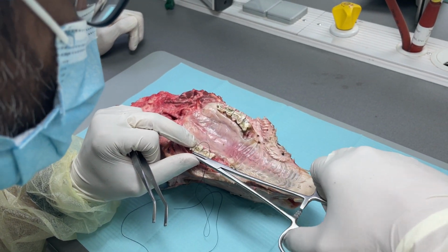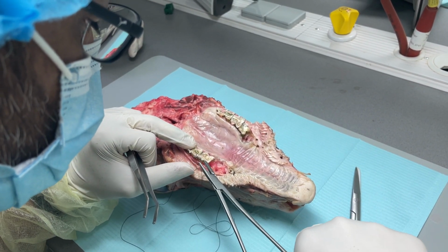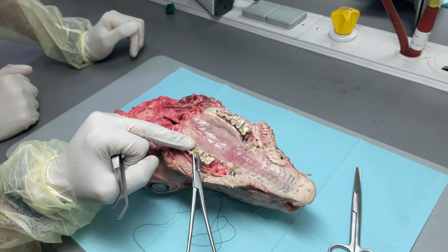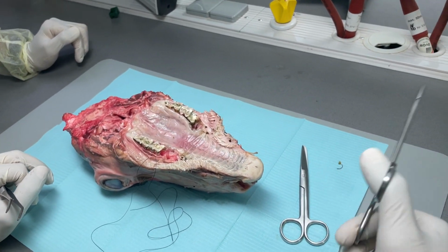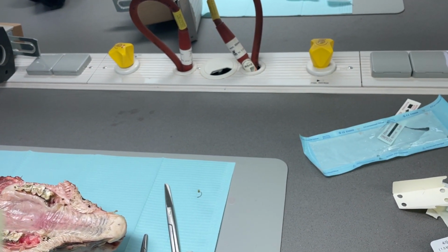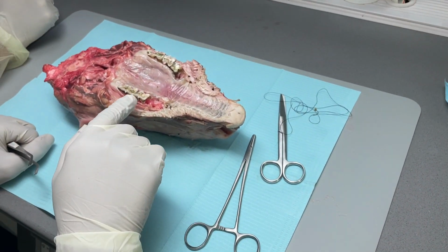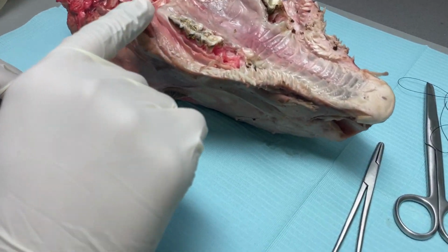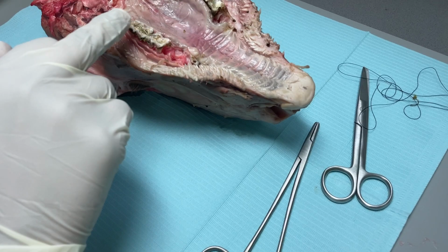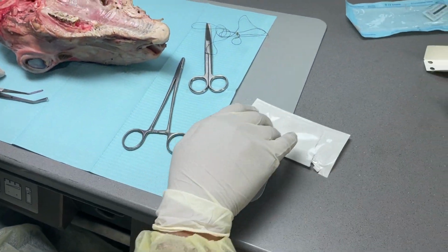Let us see if it will come, because in the goat it is a bit difficult. See, it tore off. Get me another one here. The interdental in the goat is very tight because they're chewing, so it's broad. No problem, I can show it to you there.